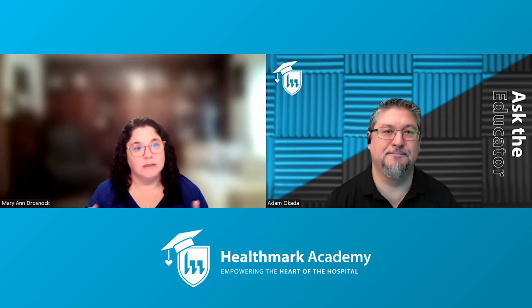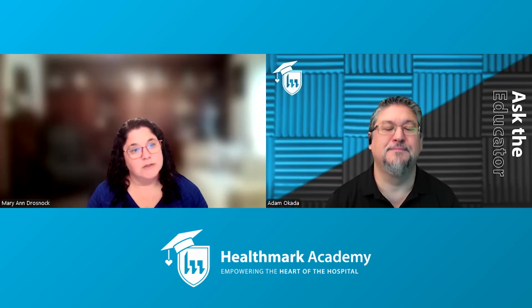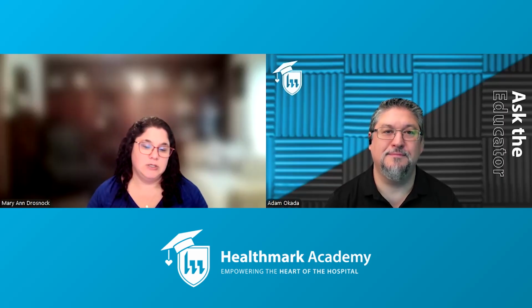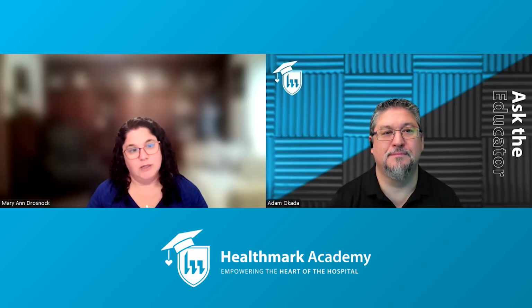And that's to call attention to these different types of scopes and to get people thinking that I need to either prioritize them or do something more with them. So we have a standard process for what to do for all types of endoscopes, right? But then there are some different designations on what you would do if it's a high risk scope versus not. Just one example that we have in ST91 is related to cleaning verification testing.